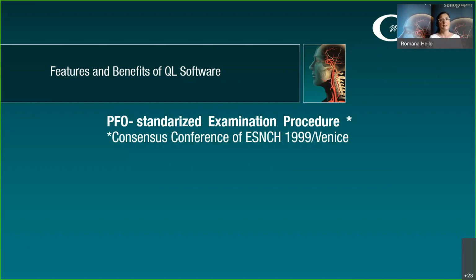It was quite simple, the test. We had no continuous record. We had no specific emboli detection module. We simply had our normal Doppler spectra, and we had the thermal printer. When we started to do the examination for PFO, at the moment that the doctor was injecting the bubble mixture, we let the thermal printer run, and so we had only the documentation on a little piece of paper. So that should have been enough.